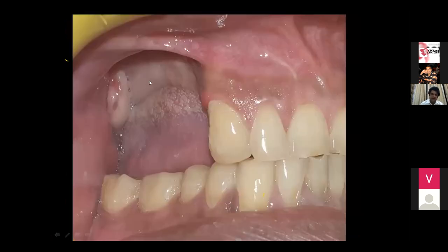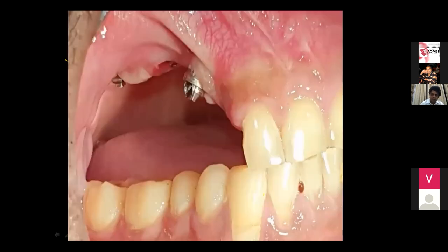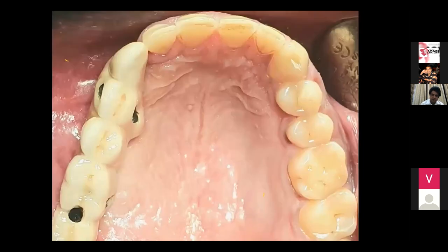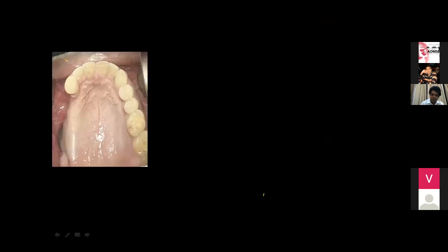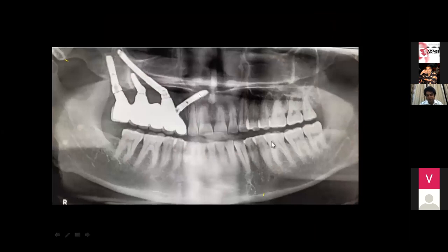So now this is how we did it. We placed an anterior implant here, like those shown in those diagrams. These are two zygomatic implants. So you can see the best possible placement of the anterior zygomatic implant was quite away from the canine region. This was his fixed prosthesis given. So you can see this anterior implant becomes important now.